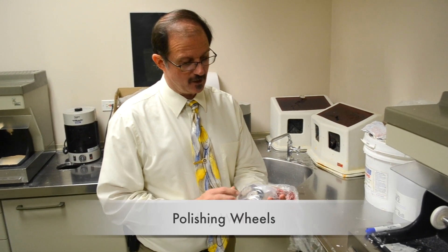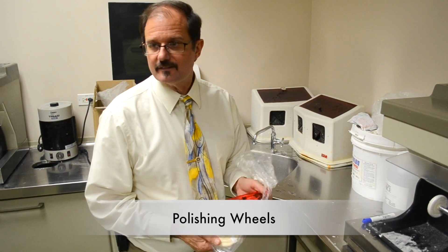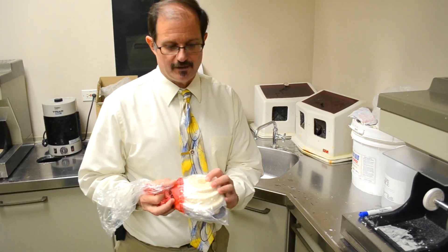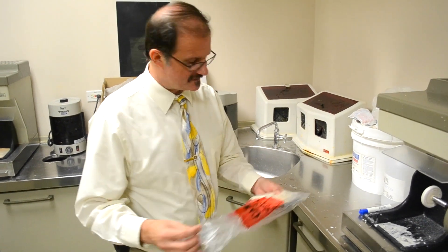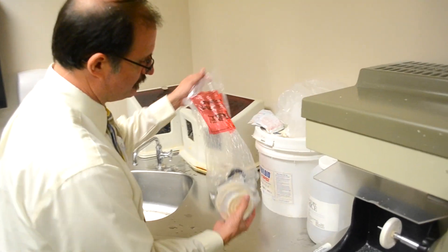Good morning, I'm Jay, and I'm going to help you guys figure out what you got in your kits. You got this polishing kit for your D1 year for dentures. I'm going to take this out and show you what you're going to use everything for.